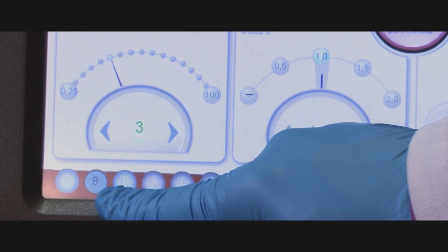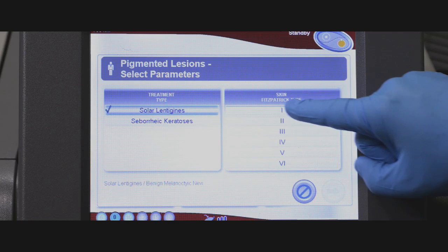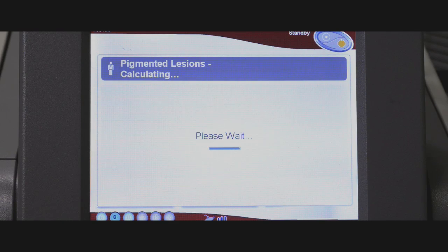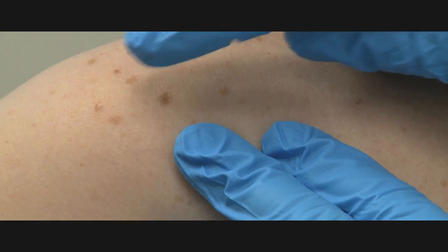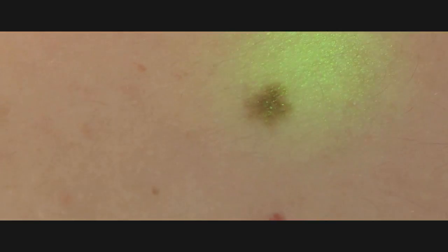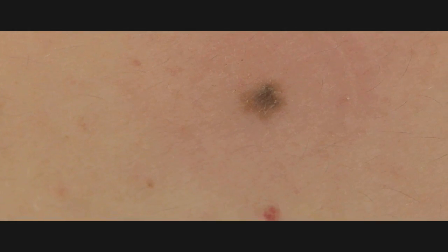In this case, we have chosen a spot size of 8 millimeters. Consult the treatment guidelines for the guided user interface for options regarding spot sizes and energies. Pulse the laser and wait 2 to 3 minutes to evaluate the response. You will see a light frosting and then subsequent darkening of the lesion.